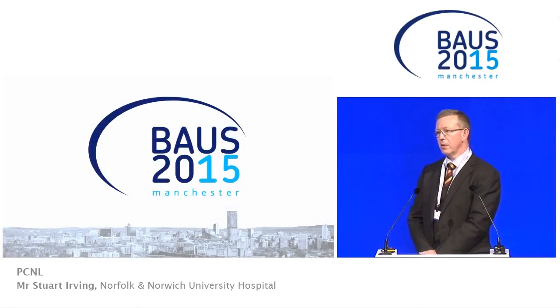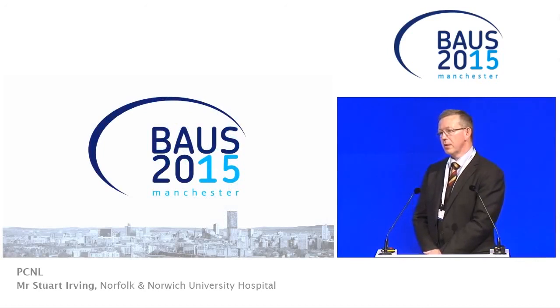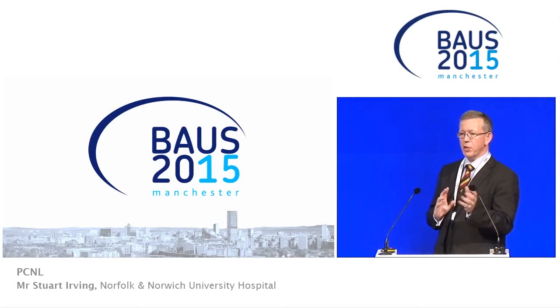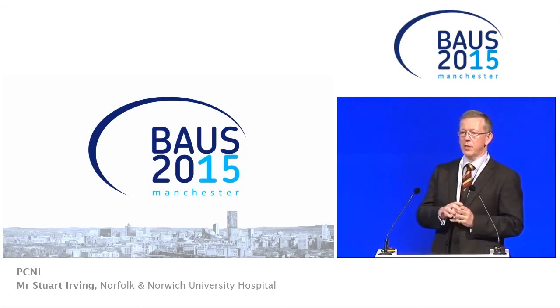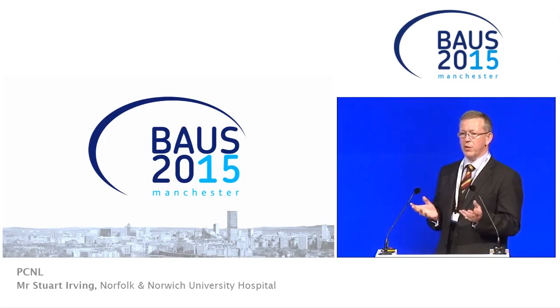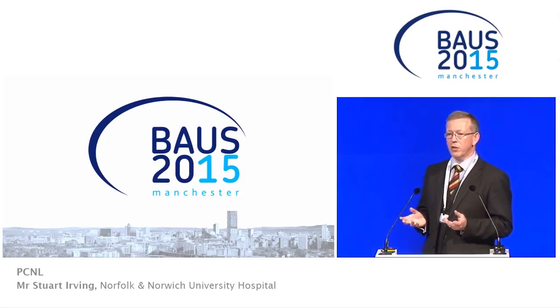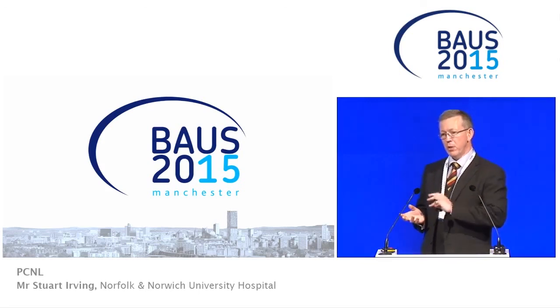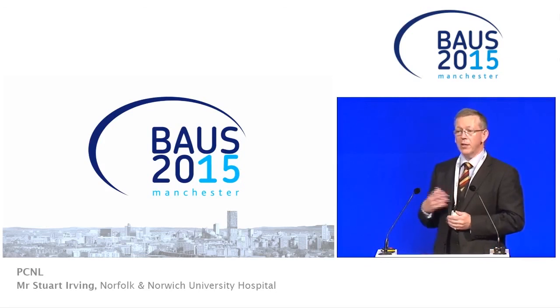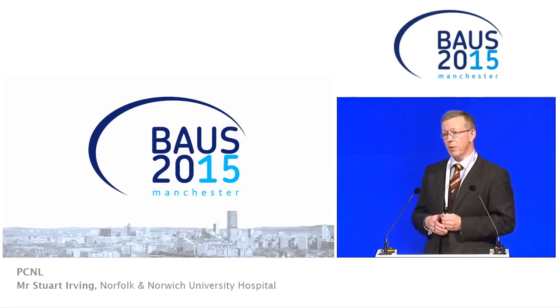Just a quick one. The access sheath, when you're doing the combined procedure, do you always use an access sheath? Because I found that you talked about the decompression of the system with supine. I've tried to stop that now. I don't know what your thoughts are. I think not always. I think in a case like this, where the ureter had been pre-stented, an access sheath will go in very easily. It just gives you the flexibility to not have the flexible ureteroscope occluding as a sort of surrogate ureteric occlusion device in for the whole procedure. You can put it in and take it out. So it just gives us a little bit more extra flexibility. And the unstented ureter would be less inclined to use one.